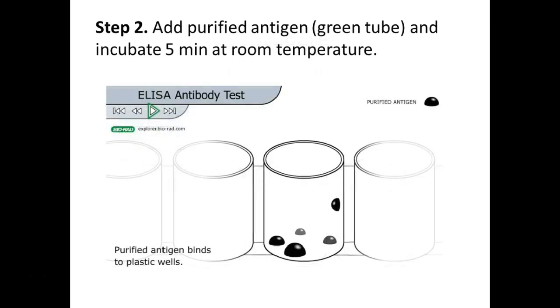Okay. So what's our first step going to be? I'm going to give you a rack with little tubes. The green tube that has the plus on it doesn't have anything on it. The green tube is the antigen, right? So it's the first one we're doing. And I didn't come up with these colors. It's in your manual in the kit. But it kind of makes sense. Green, right? Go. That's our first one.